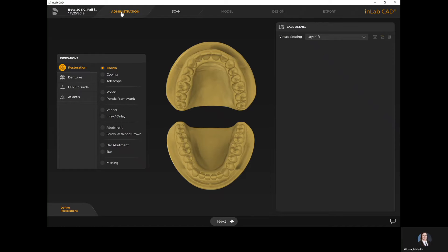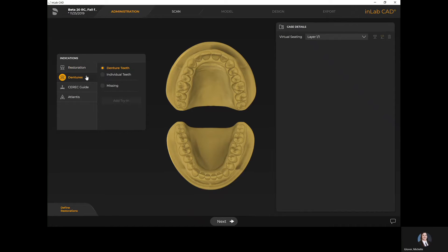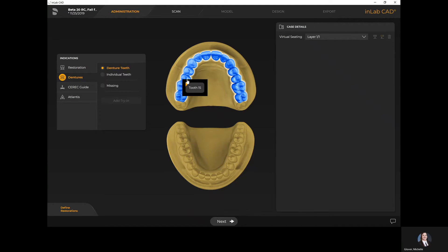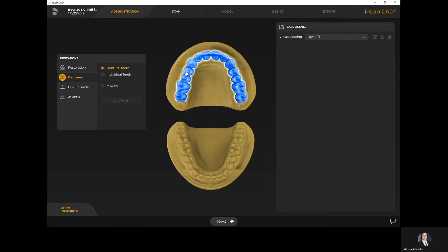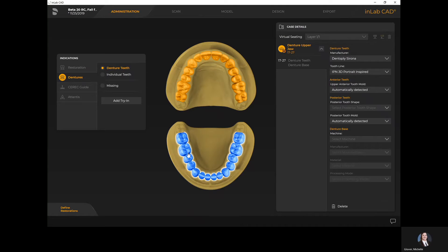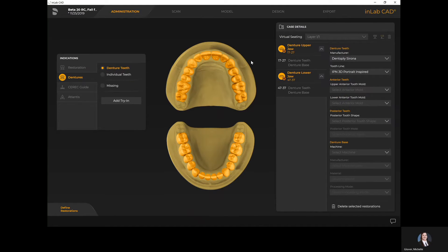We're now in the administration phase. Just like in InLab software 20, this is where we fill in our prescription — you'll see the restoration tab and the denture tab. Here I have my denture teeth and individual teeth just like in software 20. However, you'll notice I now have the ability to isolate one arch for a complete over natural dentition, but in this video we are showing complete over complete, so I'll select my two arches.